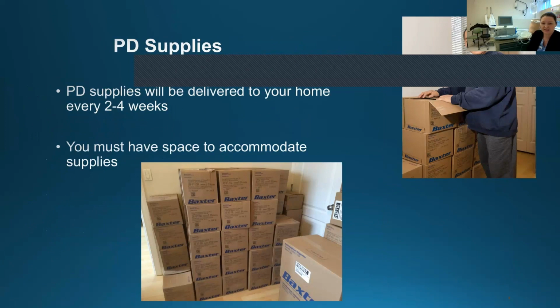So PD supplies will be delivered to your home every 2 to 4 weeks. And these are delivered from a company called Baxter. You must have space to accommodate the supplies. If you can see in the photograph, that's about how much you'll be getting at one time.